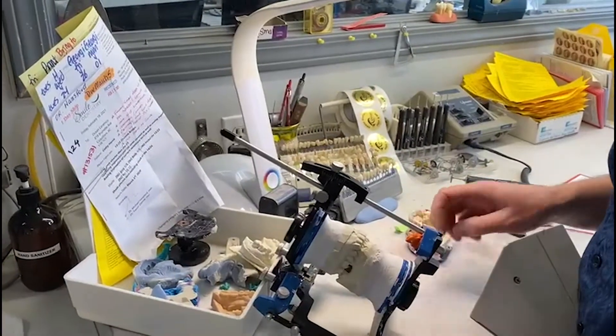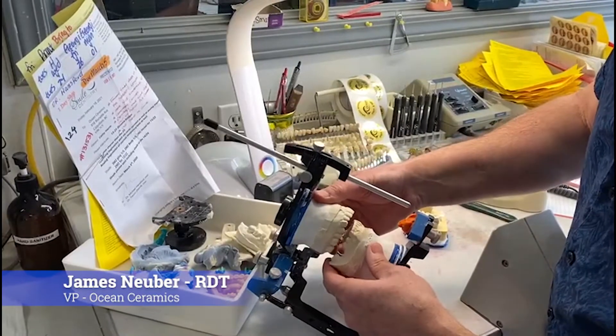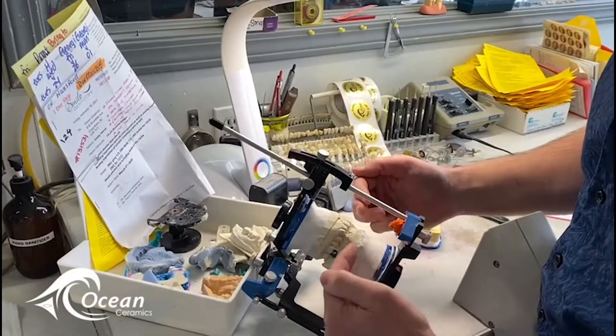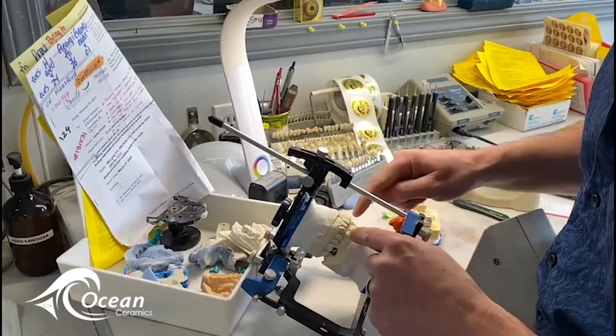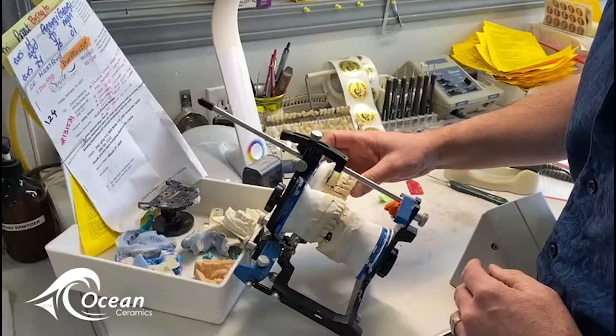Okay everybody, I just want to show you how we do a little quality control here at Ocean. We got this study model in from this doctor and what we want to do is duplicate the anterior guidance of this pre-op to this nice new bridge.